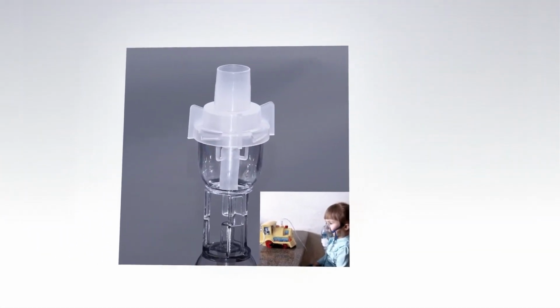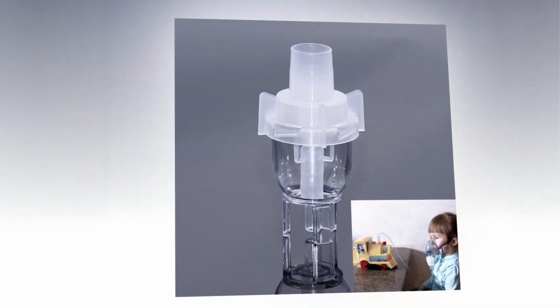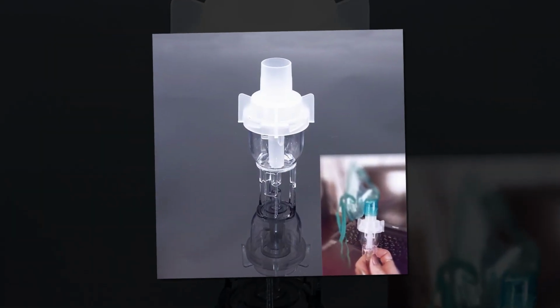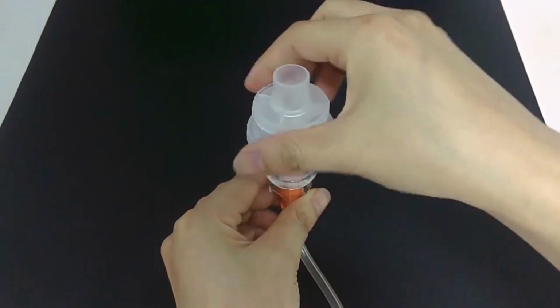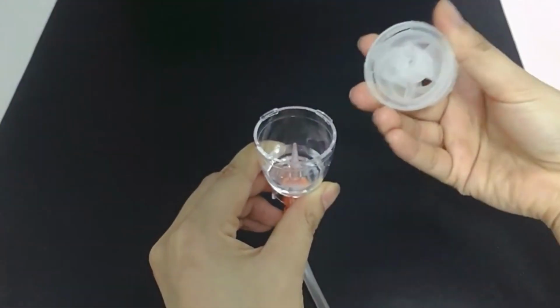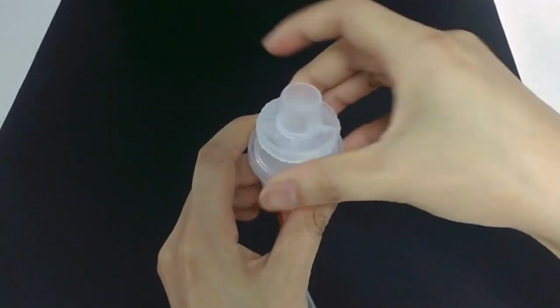A jet nebulizer is the most commonly used nebulizer. It uses an air compressor to convert liquid medicine into aerosol. As a result, it delivers most of the medication to your lungs with minimal waste. An ultrasonic nebulizer uses high-frequency vibrations to transform liquid medication into aerosol form. This type of nebulizer is much quieter than a jet nebulizer. Ultrasonic nebulizers cannot convert dense liquid into aerosol droplets. Therefore, you would not use this type of nebulizer to administer suspensions.